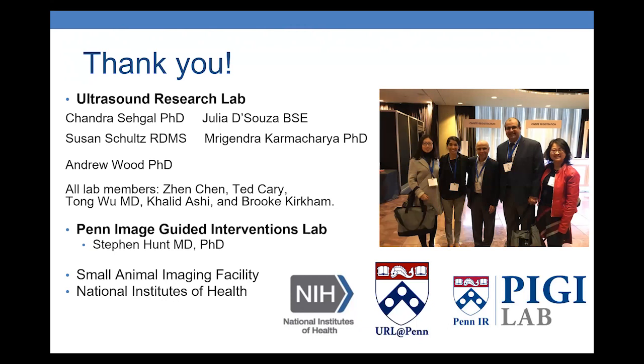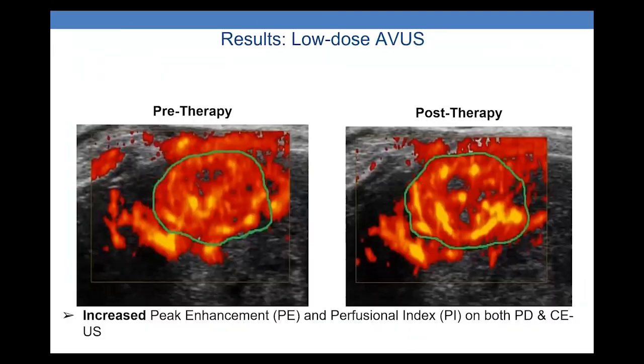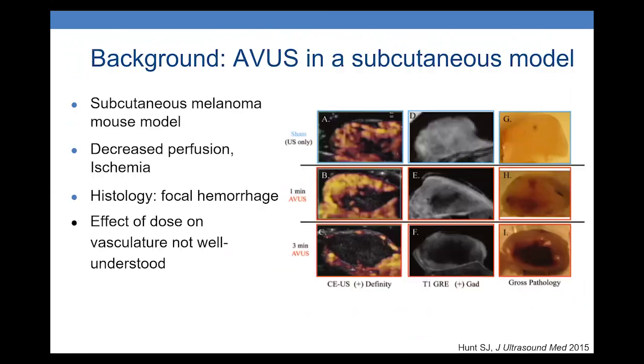Okay, yeah, I want to ask you a few details about that as well. So it sounds like what you're doing is you're just choosing regions and purely looking at brightness. How are you doing that measurement? Are you collecting RF data for that and doing analysis offline, or is it just measurements on the system? Yeah, okay. So I'll go to the slides maybe just to be more clear. Just a second.